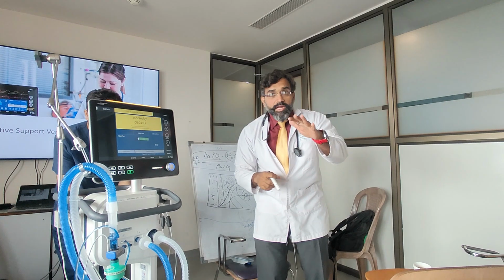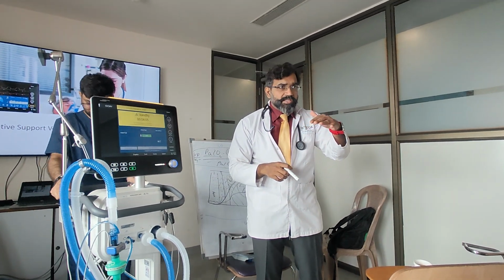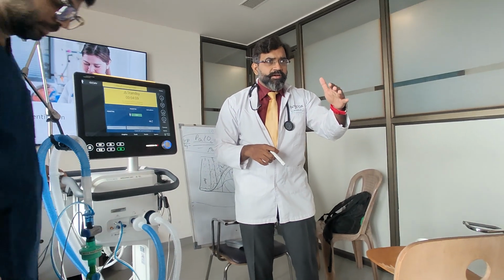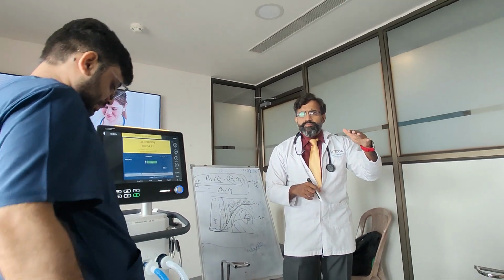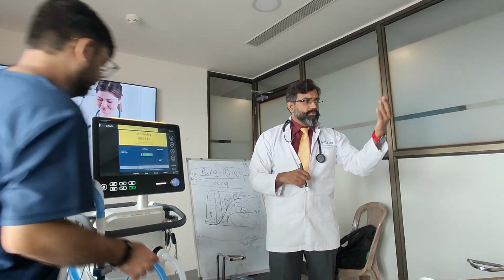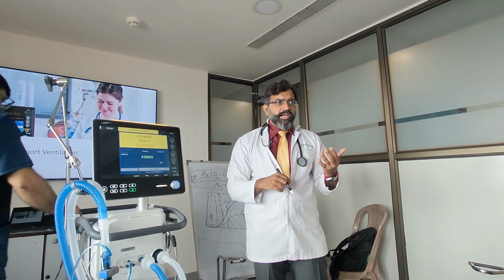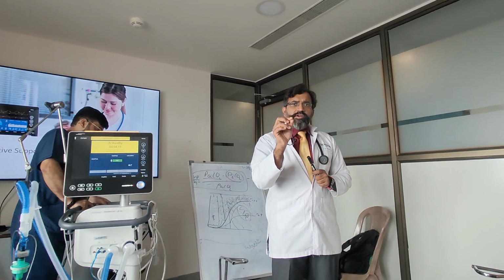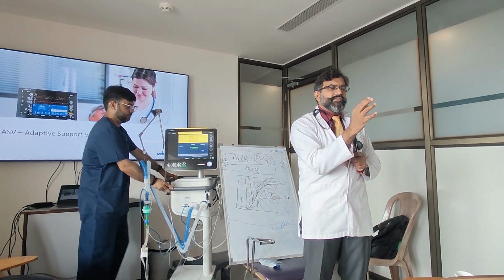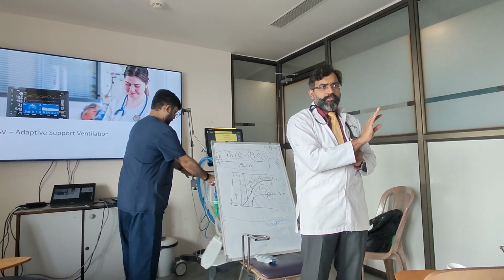That is called NeoGanesh. On the ventilator, it is called Evita Smart XL. Understanding? NeoGanesh and Smart XL. You know that? So that is closed loop. What is the loop over there? Closed loop. The carbon dioxide is increasing, I am changing one parameter. So it's a kind of a small closed loop that you are having.